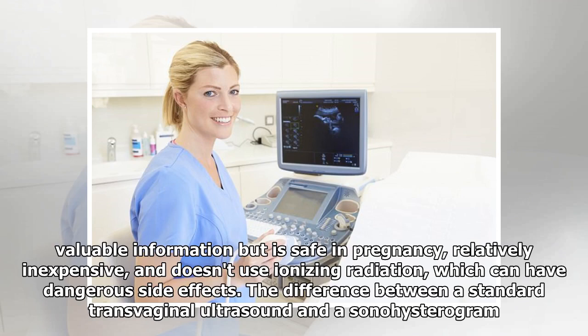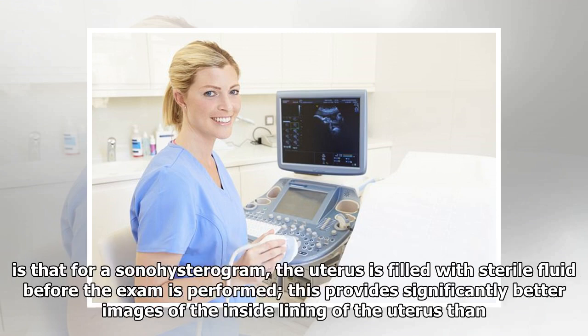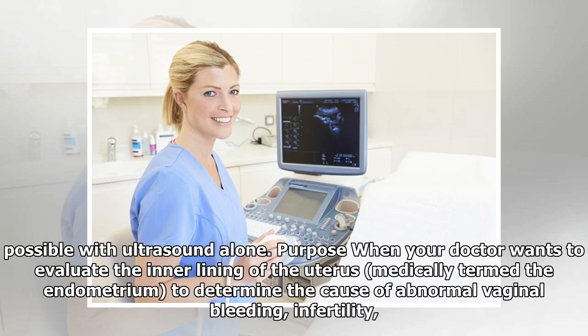The difference between a standard transvaginal ultrasound and a sonohysterogram is that for a sonohysterogram, the uterus is filled with sterile fluid before the exam is performed. This provides significantly better images of the inside lining of the uterus than possible with ultrasound alone.